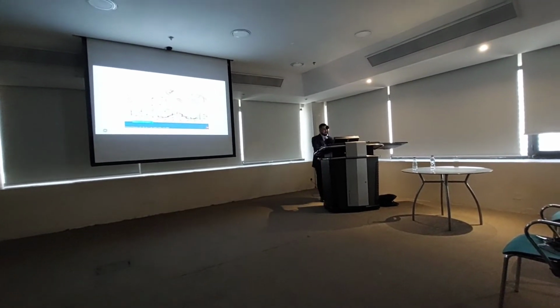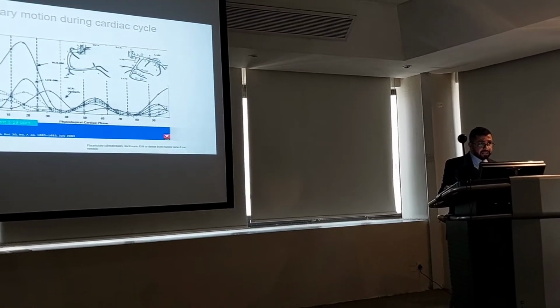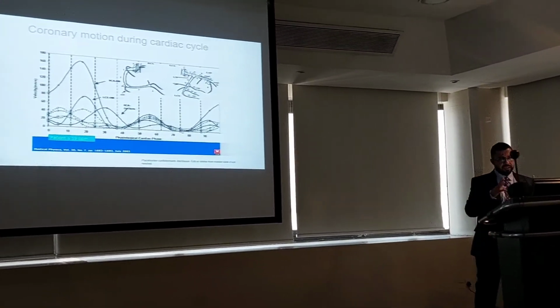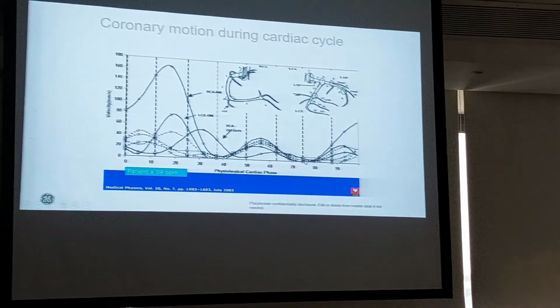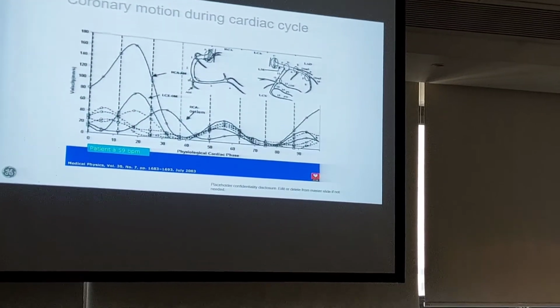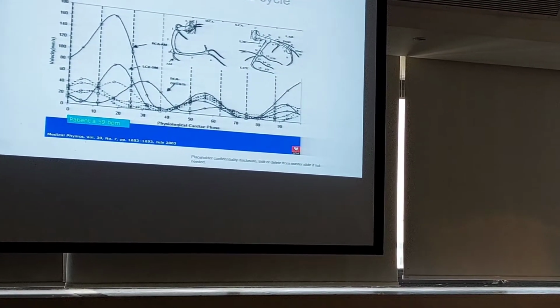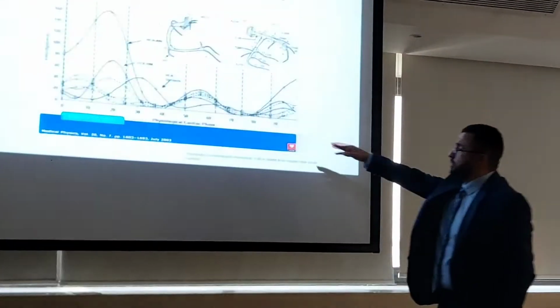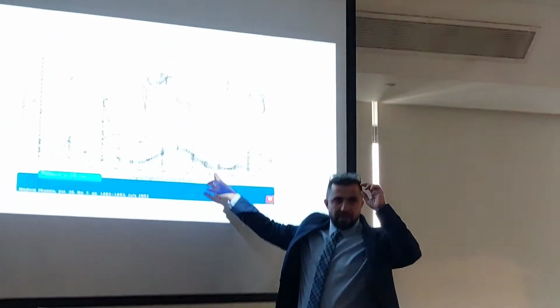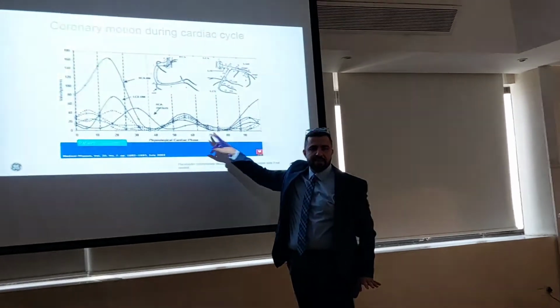As you can see, in the diastolic phase, 75, the heart is expanding. It's getting ready to pump. So at this moment, almost all vessels will have the least motion. This is the best time to capture. 75, in the diastolic phase.